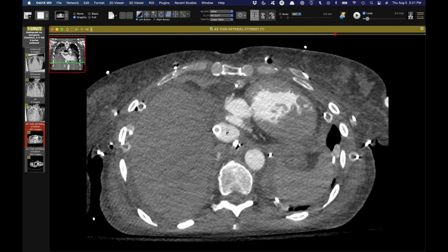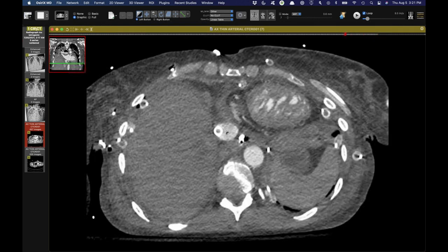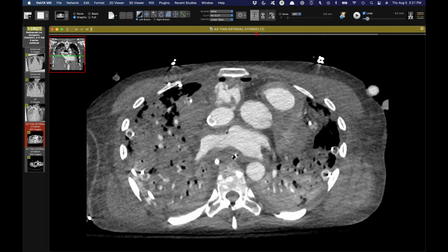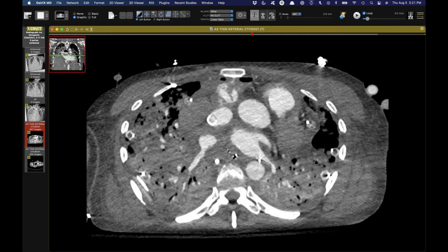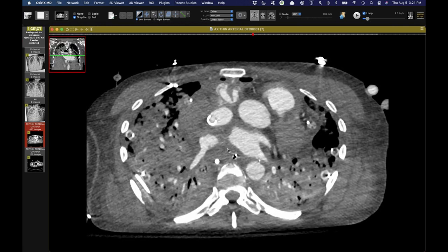Yeah. Or one that's draining more inferiorly. Is that your understanding? Yeah, it's dual channel. I don't know if I recognize the actual product. And this is the first one I've seen that has been placed via a subclavian rather than a jugular vein. That's unusual.